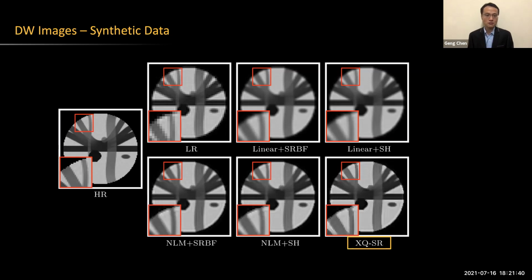Yeah, I think this should be the major challenge for us currently in using graph convolution neural networks for diffusion MRI. Yeah, thank you. I think all of us have the same problem, actually. You're trying to circumvent the RAM issues, the memory exploding, by making the data smaller and prolonging the time of the training.